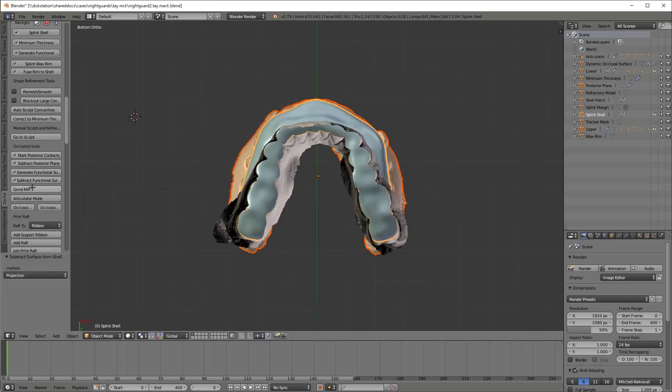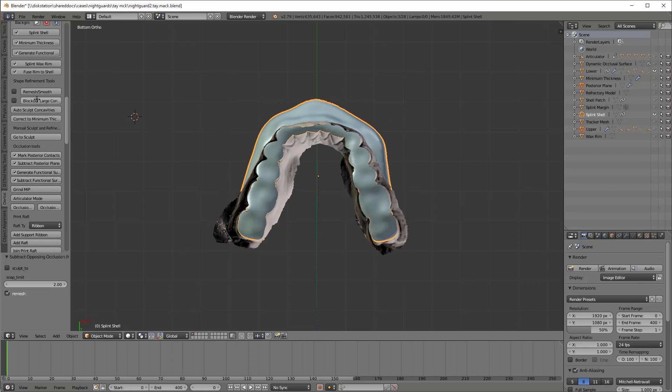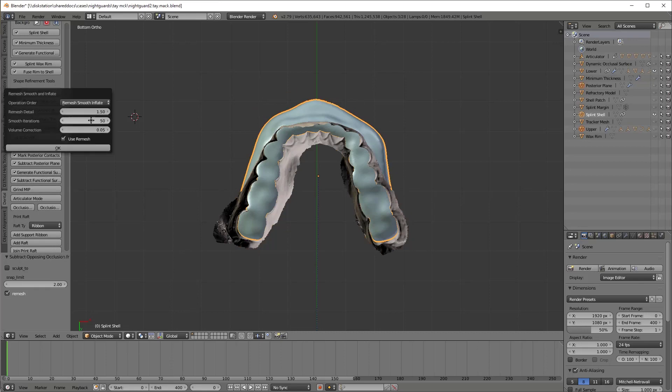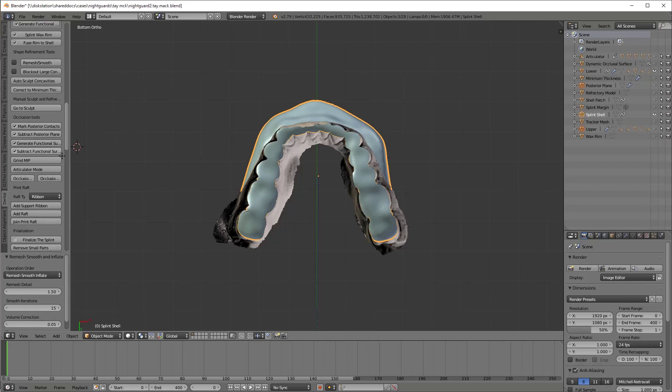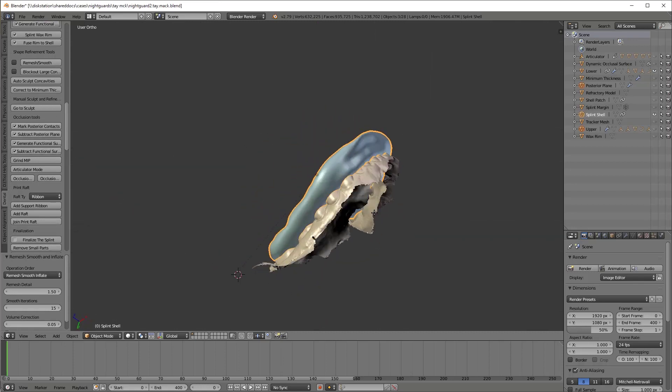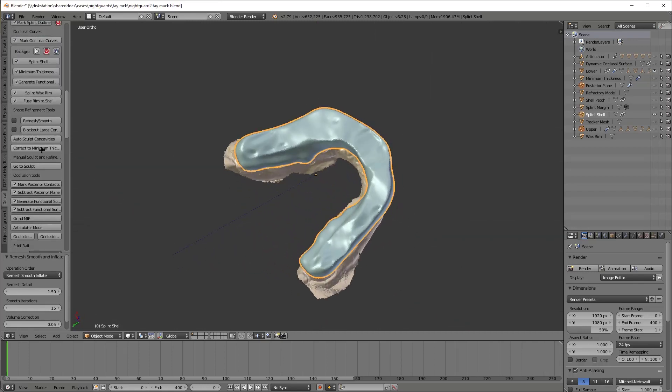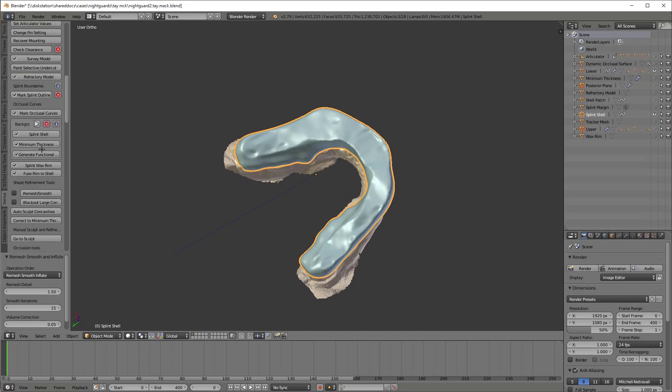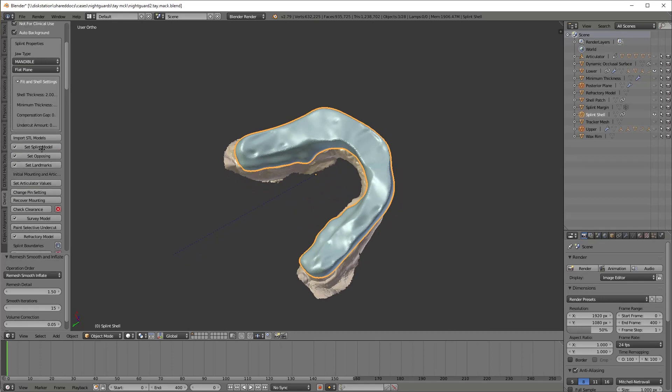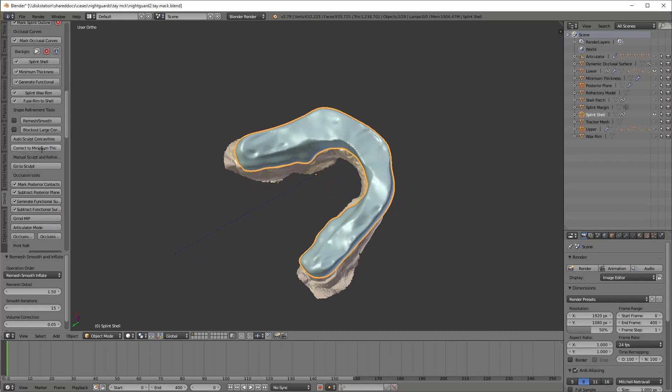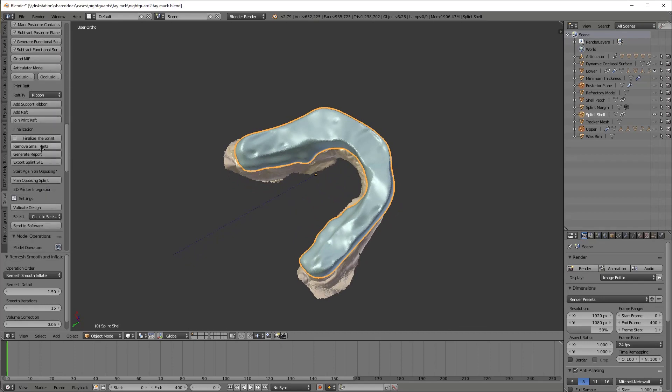I'm going to go ahead and subtract out a bunch of things now. It doesn't show you it, but while you're making it, it actually has generated all the excursive movements and deleted them out. So now you have full support for anything and all the excursive interferences have been removed. I'm going to go ahead and trim it.